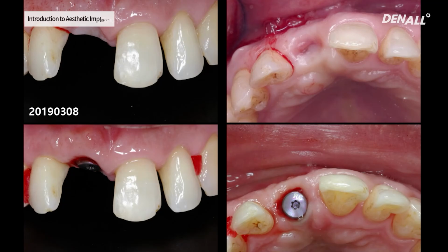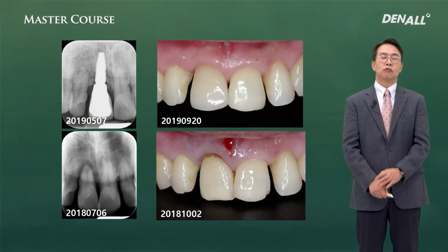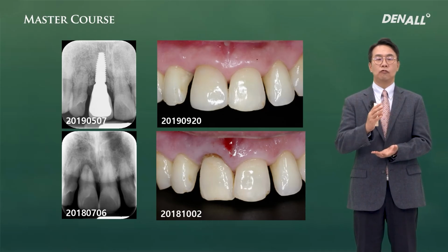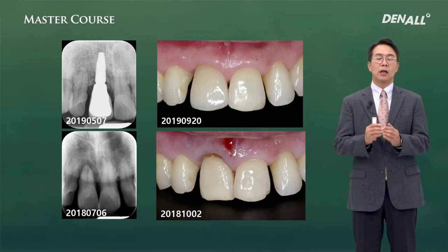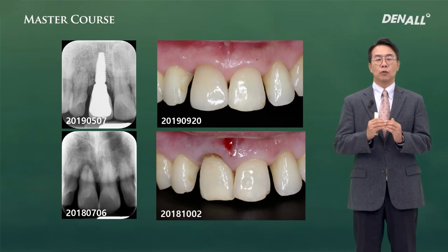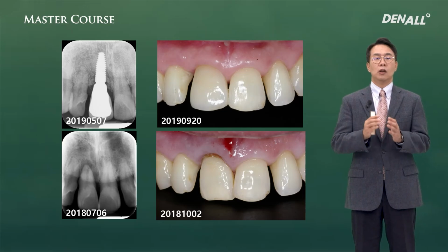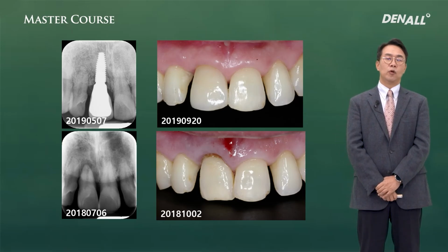the shape of prosthesis is devised. Placement depth and the appropriate prosthesis shape were delivered. If you compare pre-op and post-op, the below photos are pre-op. The gingival line compared to pre-op is maintained in a very natural way, and the shapes are improved.